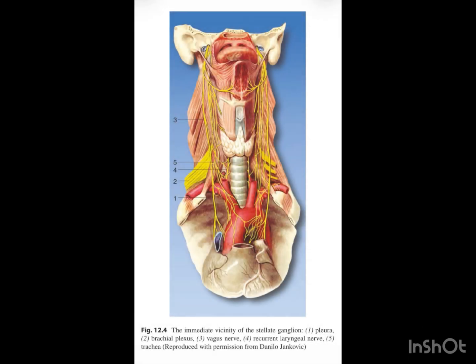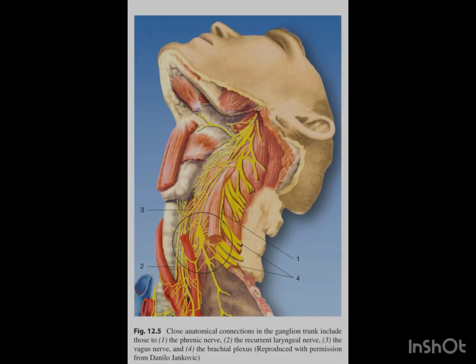The stellate ganglion is composed of fusion of the inferior cervical ganglion with the first thoracic ganglion. It is situated in the region of the lower part of C7 extending to T1 transverse process. Attempts to block the stellate ganglion at C7 to T1 may result in several serious complications at this level, and thus it has been considered safer to block it at C6 instead.